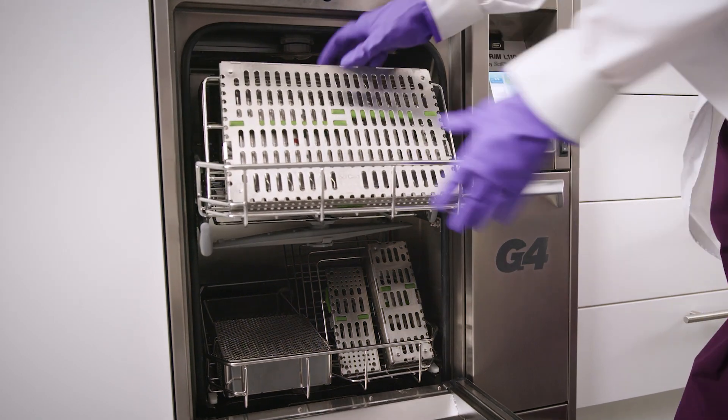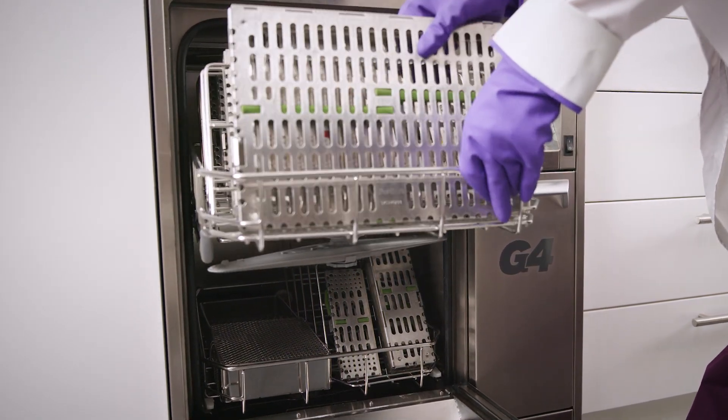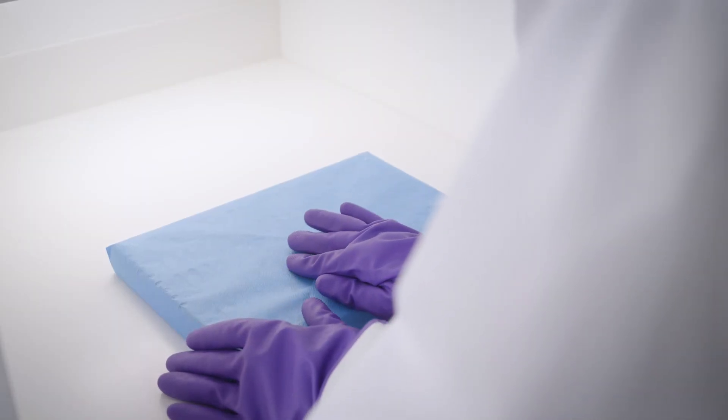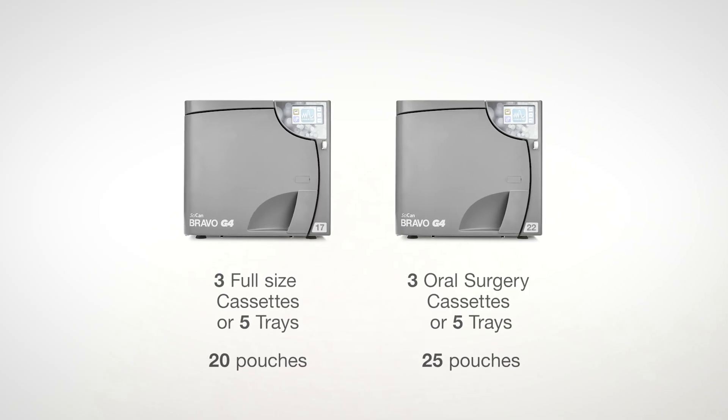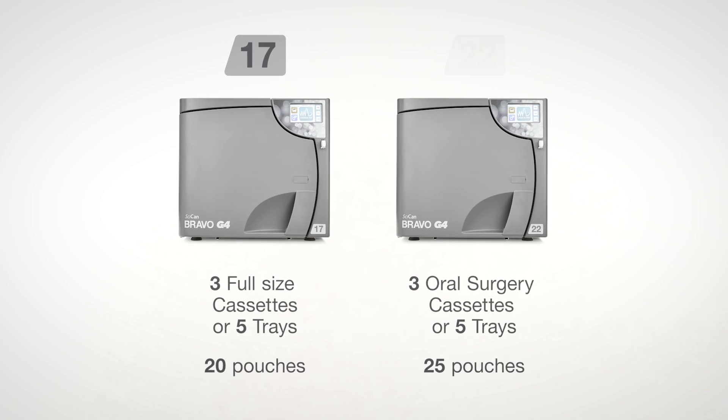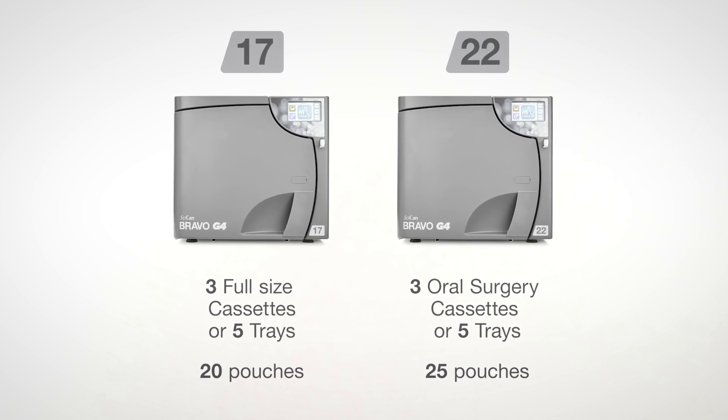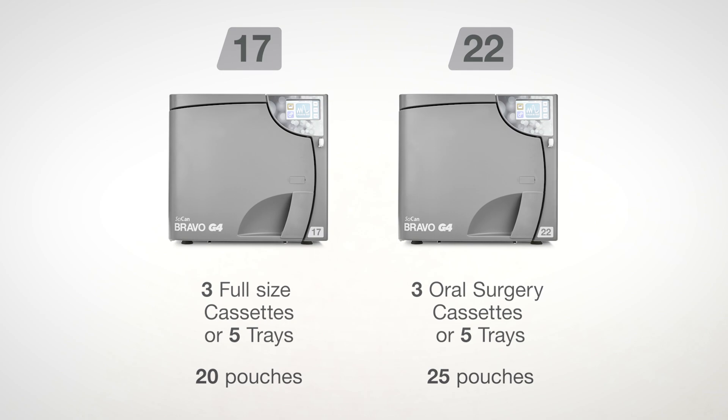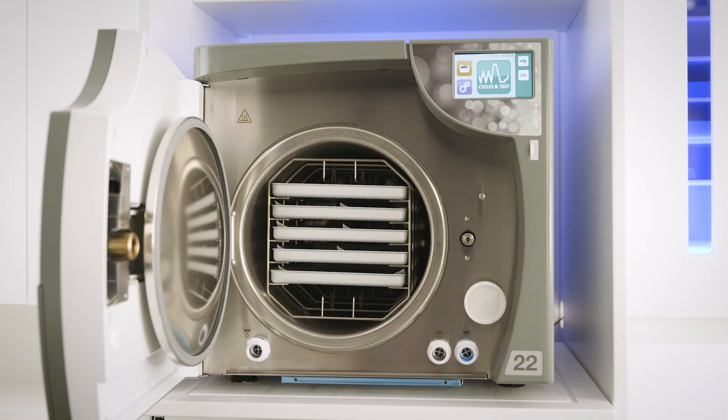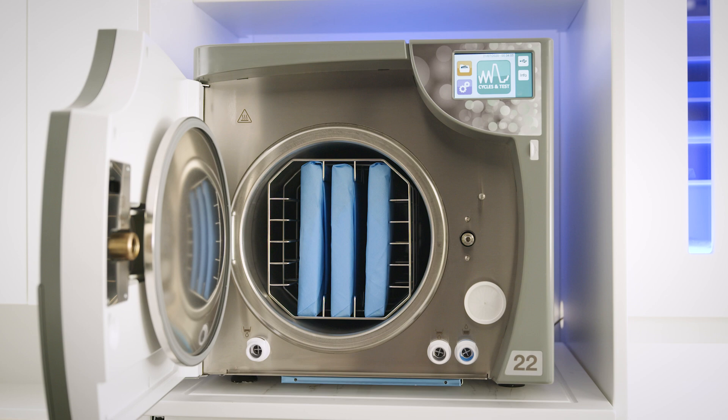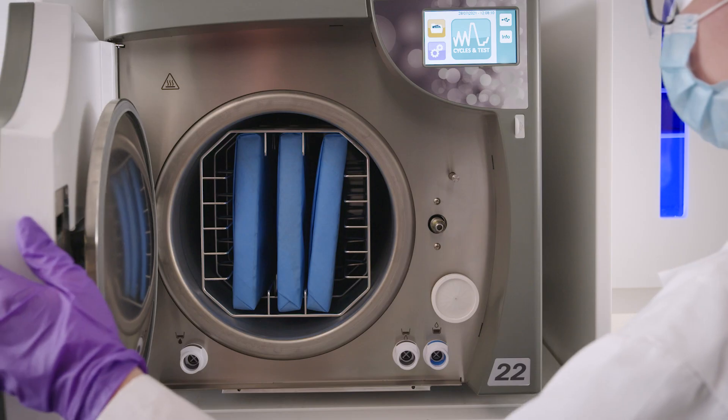The instruments must be cleaned, rinsed, dried, and wrapped before being placed in the Bravo G4. The Chamber Rack included with the 17L and 22L Bravo G4 will hold 3 cassettes or 5 trays. Pouches should be carefully arranged on the tray, plastic side down, and in such a way that they do not overlap. Place the cassettes or pouches in the chamber and close the door.